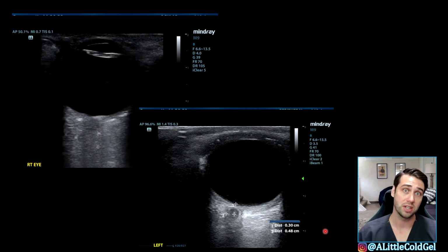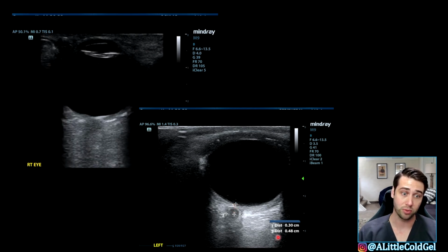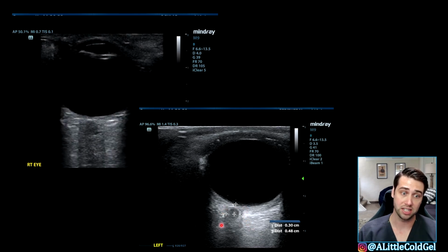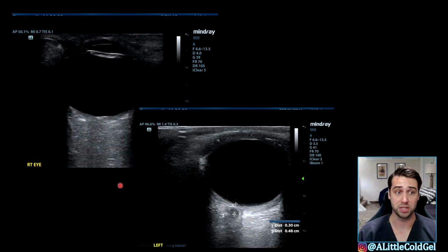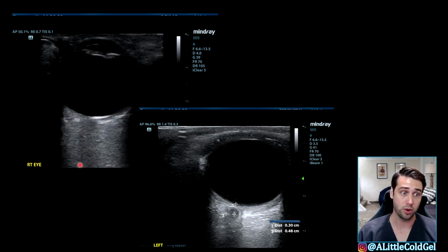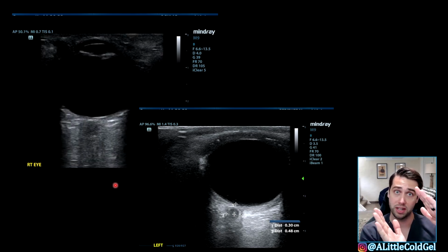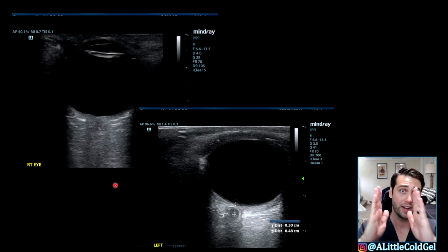So the way you measure it that you have to remember is that you go 3 millimeters back from the retina, and then you measure from each of these little lines over here, like the walls of the optic nerve. And the other thing is having it in the correct position. So as the eye moves, the optic nerve will obviously kind of change orientation, and you want to measure it at the point where the two walls are parallel to each other. If they're at an angle to one another like this or like this, you will probably get a falsely high or low measurement. So you want to find them where they're parallel.